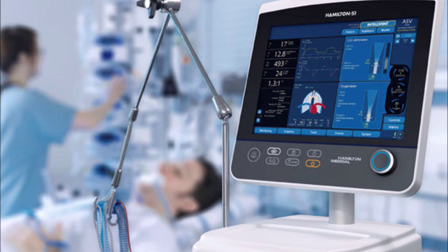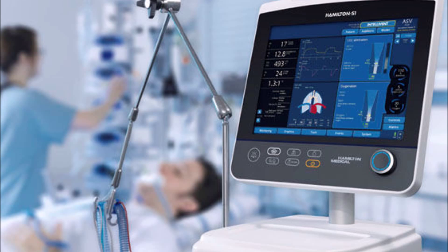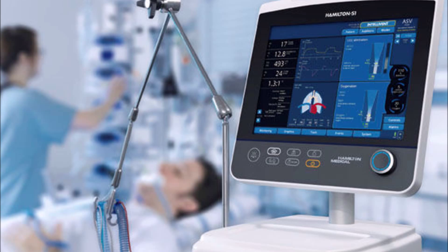There is also a piece on the front with the display, and when it has a timer showing the amount of time it's been looking at it, that means the patient is able to be extubated, because it's done a weaning trial already.